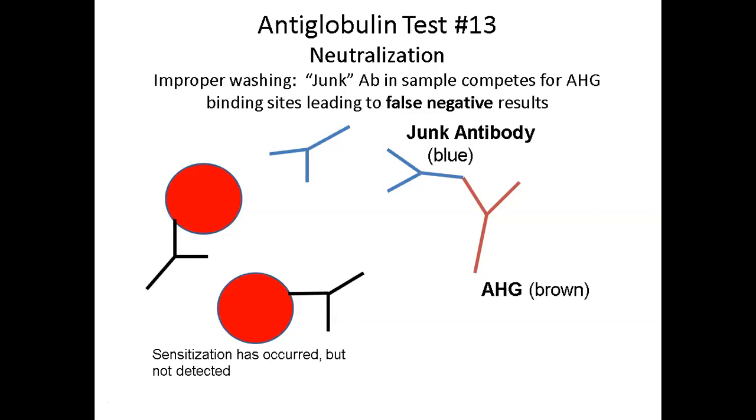And so you guys will get to do some of this testing actually, even though this course is completely virtual and online. When we come back, hopefully in the fall, we'll have 1 or 2 labs in blood bank just so you guys get some hands-on with doing some of the techniques. So anyway, if we don't wash properly, look what's hanging out in the tube as well.